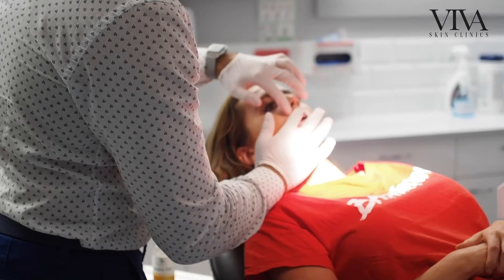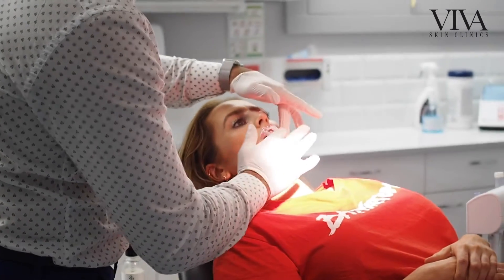So we're going to be applying some local anaesthetic and then we'll go from there. This numbs the lip, making the procedure as painless as possible. When you know the local anaesthetic is working properly, the lips feel super numb.